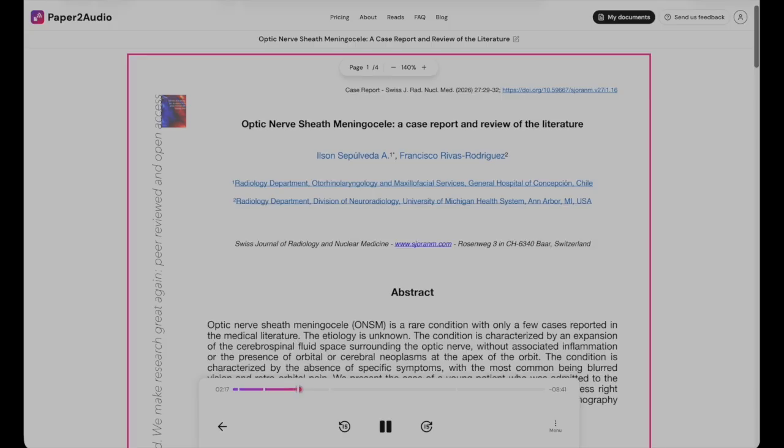Case report. A 16-year-old patient was admitted to the emergency department of an external hospital with painless right exophthalmos. No history of head trauma or other neurological deficits was detected. A CT head was performed. The images revealed a well-defined hypodense cystic mass located just behind the right eye, with evidence of displacement of the extraocular muscles. There was no evidence of bone expansion or erosion.